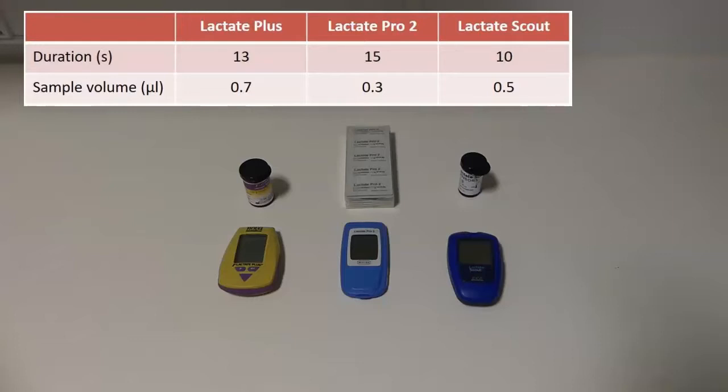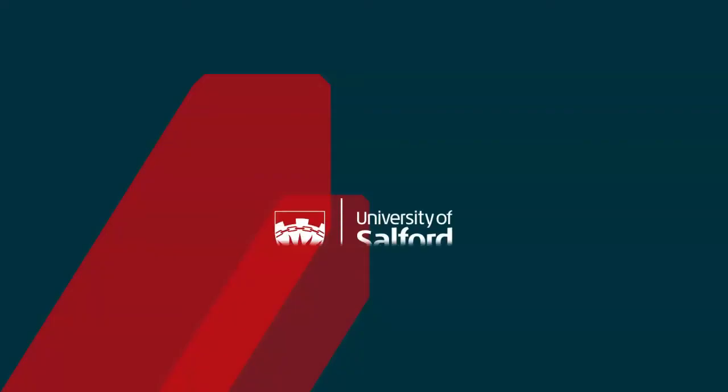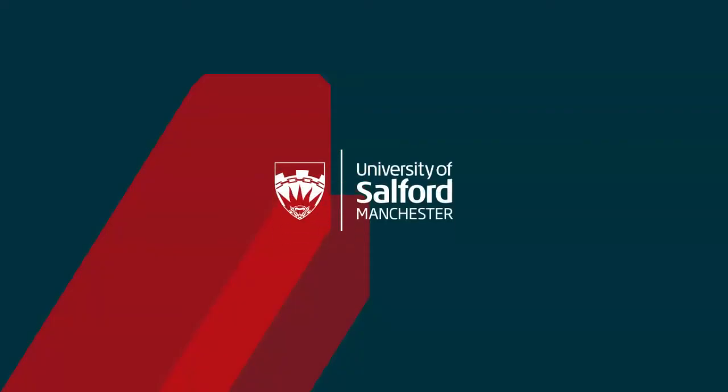However from a practical consideration the process to use them is exactly the same in which each device has its own test strip which you insert and draw the blood via capillary action and then wait a short period of time for the result. Therefore whichever portable analyzer you use please follow the process shown in this video.